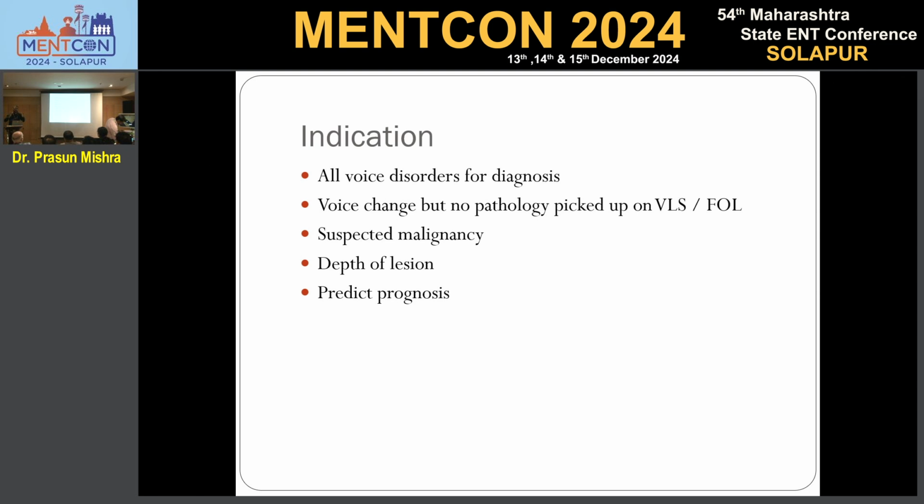All patients with voice change should be strobed because it gives us a lot of assessment. The patient has obviously taken some basic treatment from a general practitioner, physician, or from us only, maybe with antibiotics, decongestion, steroids, and now he wants, I want my voice back.